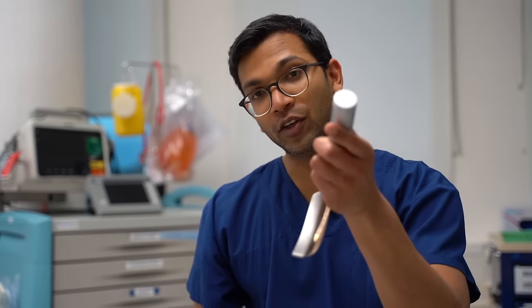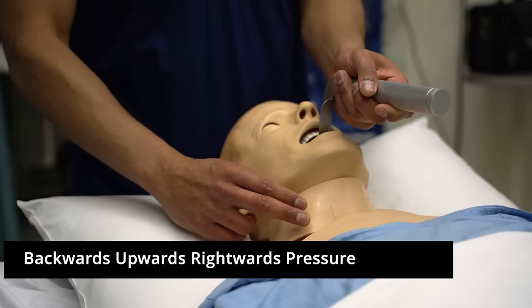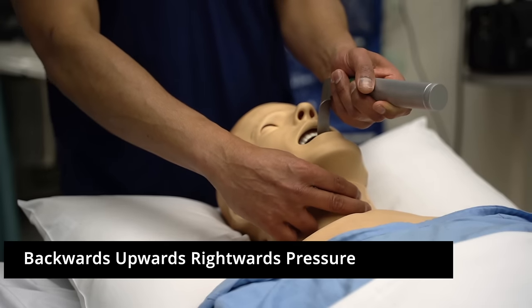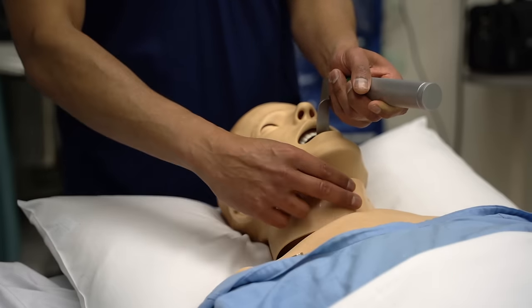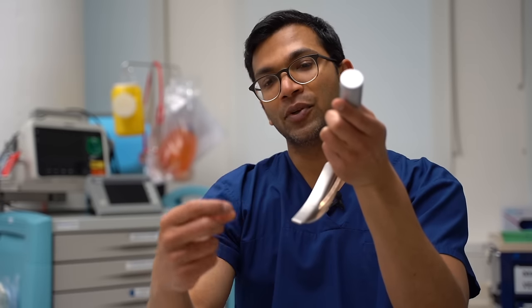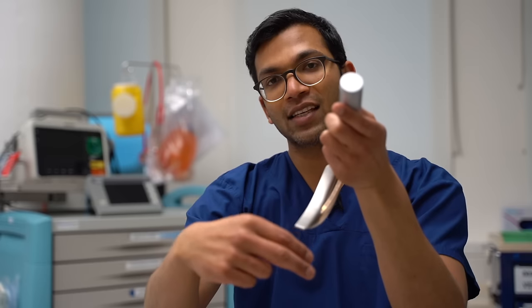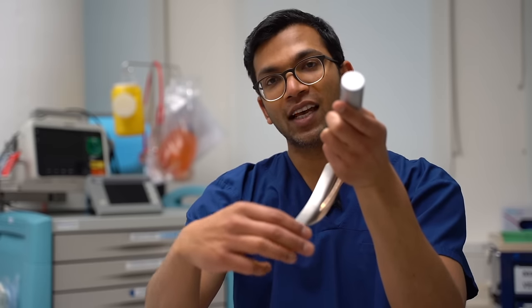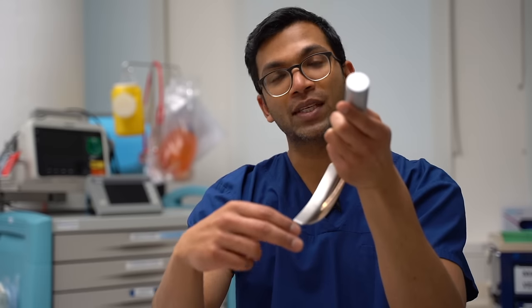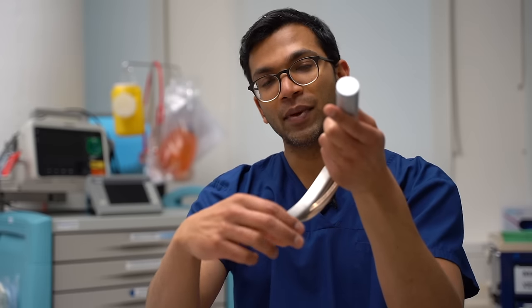Finally, the three Bs: Burp, Bougie, Blade. Imagine I've got my laryngoscope in and I've got a view. I put my hand on the larynx, on the thyroid cartilage, and move it backwards, upwards, and rightwards — that can improve my view amazingly well. After that, I still need my right hand, so I get the nurse to place their hands on the thyroid cartilage and I may move the nurse's fingers as I see fit. That's a really good technique — they can't see what you're seeing, so you guide their hands to exactly where you want the larynx.